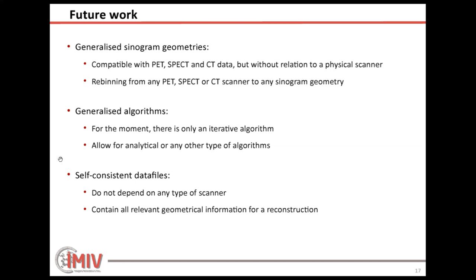And then we also want to be able to have self-consistent data files, in the sense that they do not depend on any type of scanner and do not require any scanner description, so that we just provide a list of events with an embedded geometry description of each event. This can be convenient to test many different things.